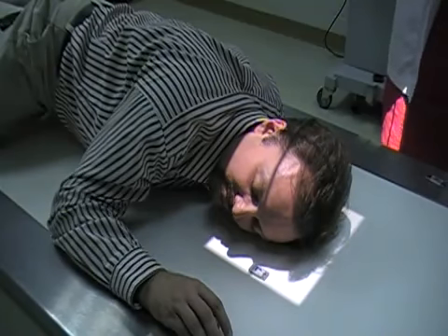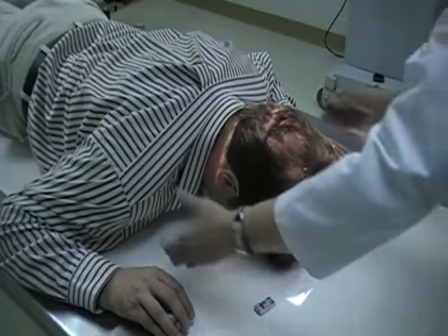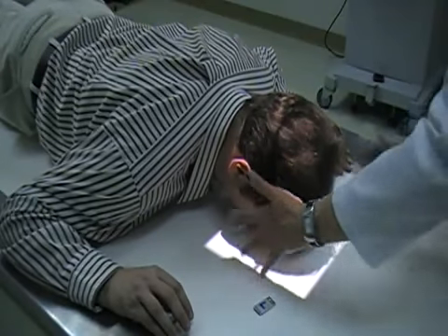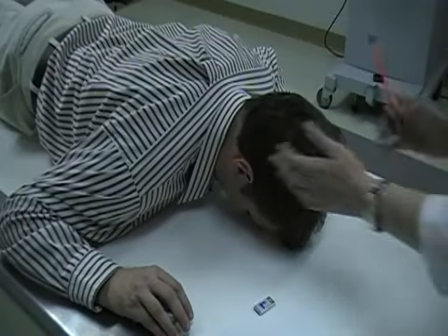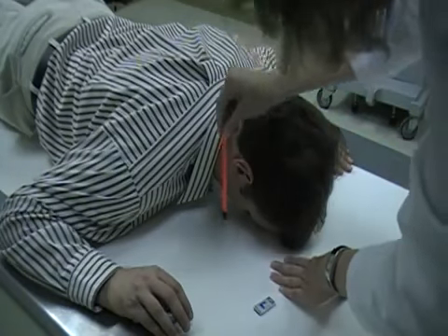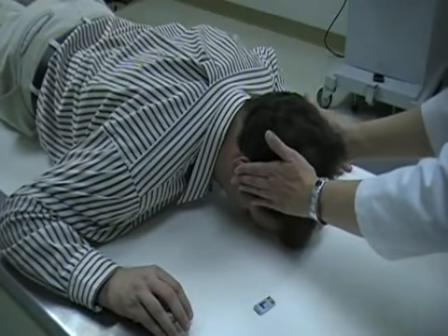Alright, next we're going to do the PA skull. So he's going to put his forehead and nose up against the table. And I'm going to scoot him over just a tad to get him more central. Okay, and then check that the forehead and nose is touching. Make sure that the head is not rotated because you do want that mid-sagittal line straight. And you want to check and make sure that the orbital meatal line is going perpendicular to the table.